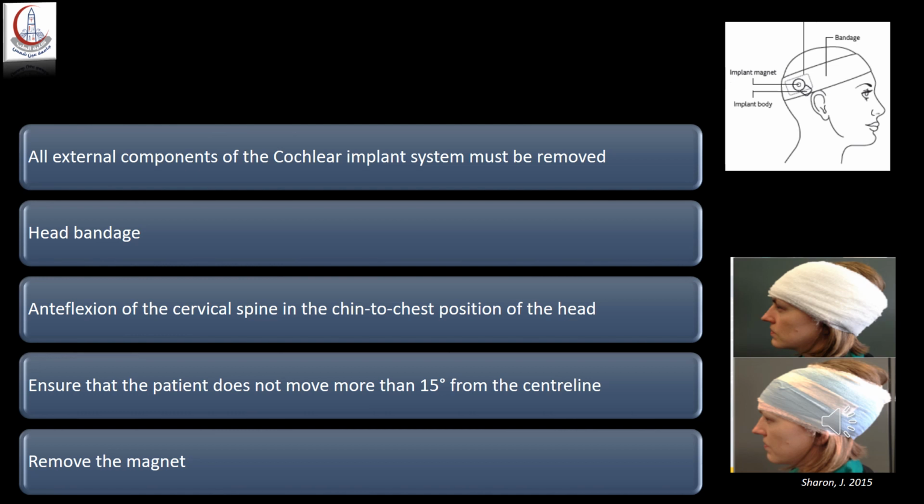Usually, we like to put a headband on the internal component to wrap it solidly, so as to minimize the effect of the magnet on the displacement and on the heat generated on the internal magnet, so it is not displaced and it does not cause pain to the patient.